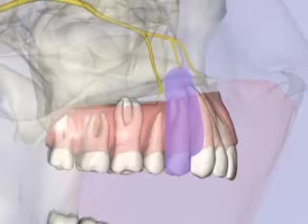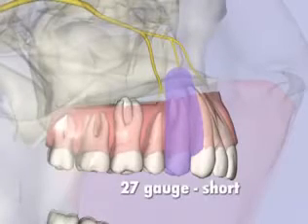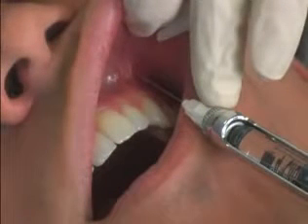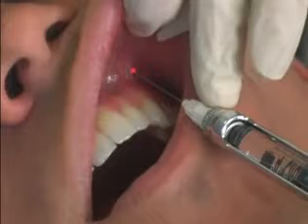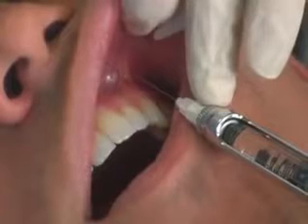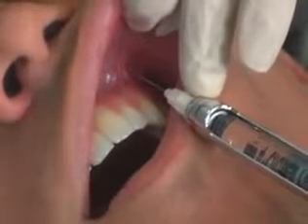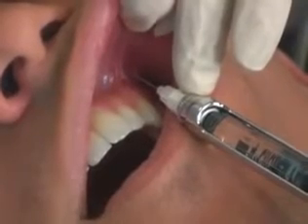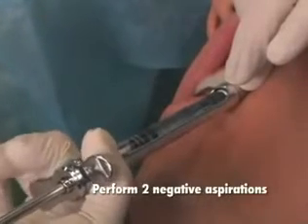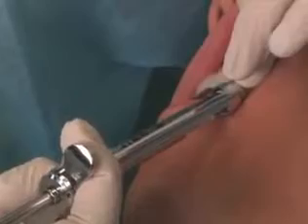The recommended needle is a 27 gauge short. The insertion site is at the height of the mucobuccal fold over the apex of the tooth to be anesthetized. The needle is held parallel to the maxillary bone and inserted until the needle tip is at or above the apex of the tooth. After two negative aspirations, one-third of a cartridge of local anesthetic is slowly injected.